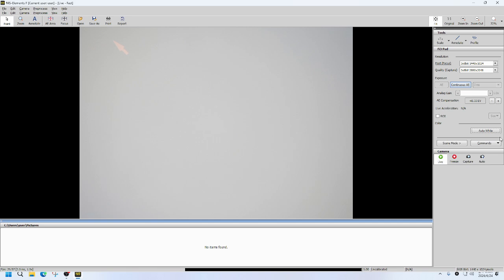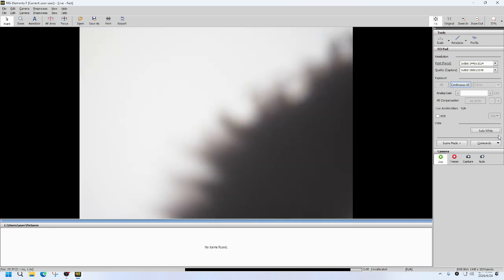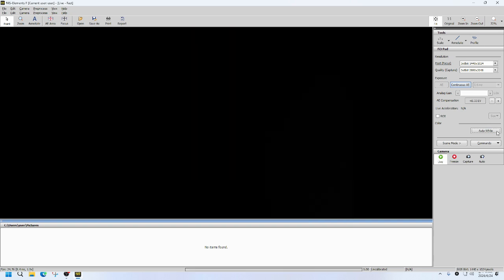Okay, so the first case is a voided urine specimen. This is from an 81-year-old male who had a past history of urinary bladder high-grade papillary urothelial carcinoma, as well as urothelial carcinoma in situ. So this is a follow-up urine specimen.